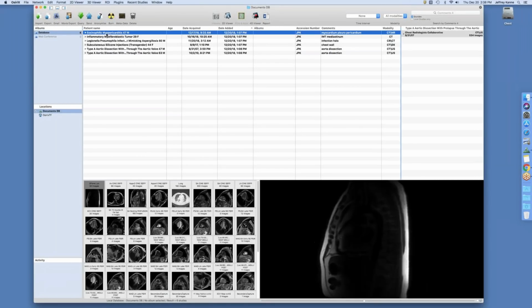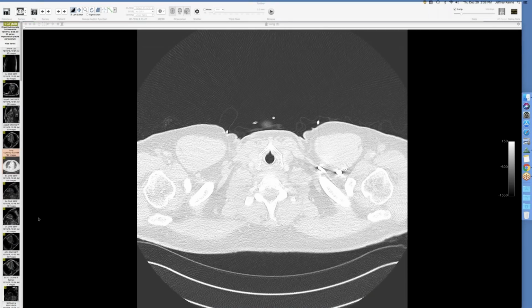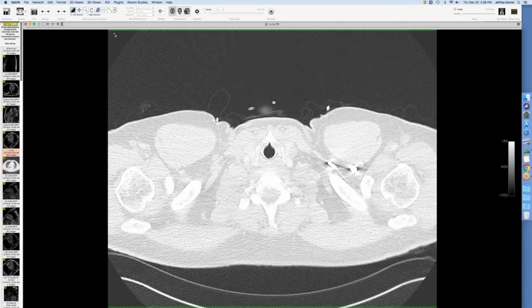All right. Now this is a cool case, and I'll show it in the order that it was presented to me because this was a transfer patient. So this is a younger patient. I think he's in his 40s. I wrote it down, or maybe 50. He's 47. Has a history of asthma, and apparently he self-medicates with prednisone when he gets flares.